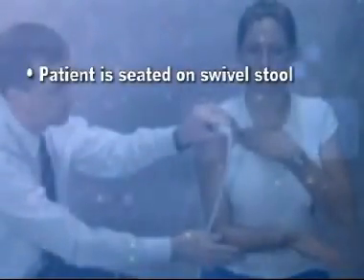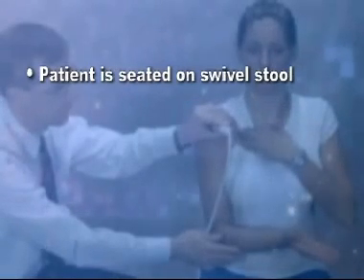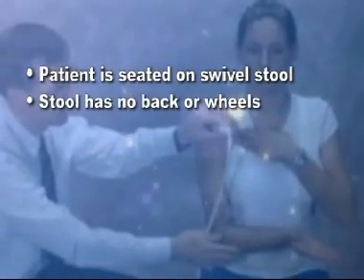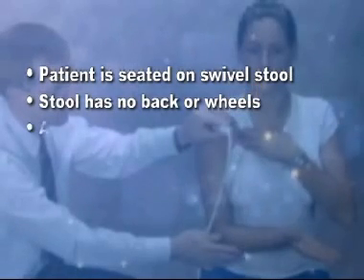The patient is seated on a swivel stool without wheels. If possible, the stool should not have a back.